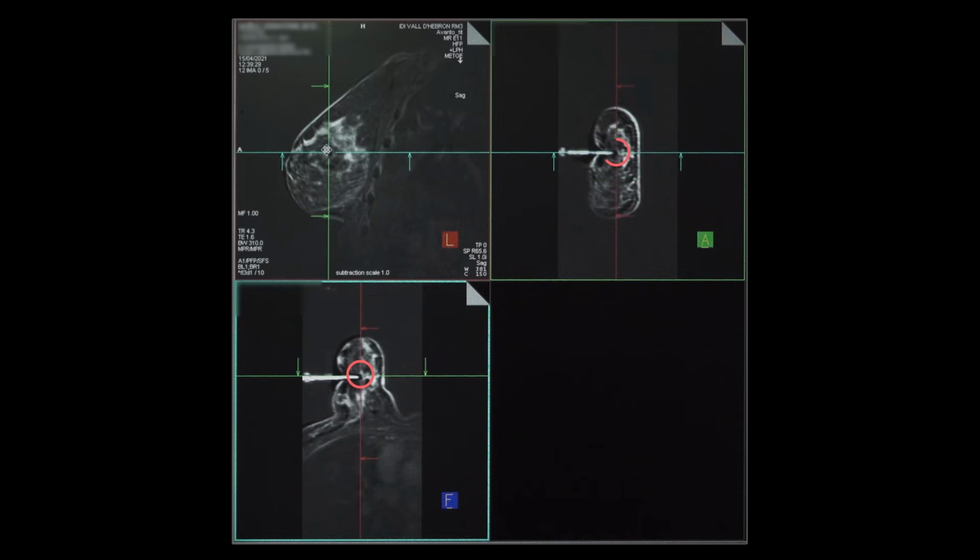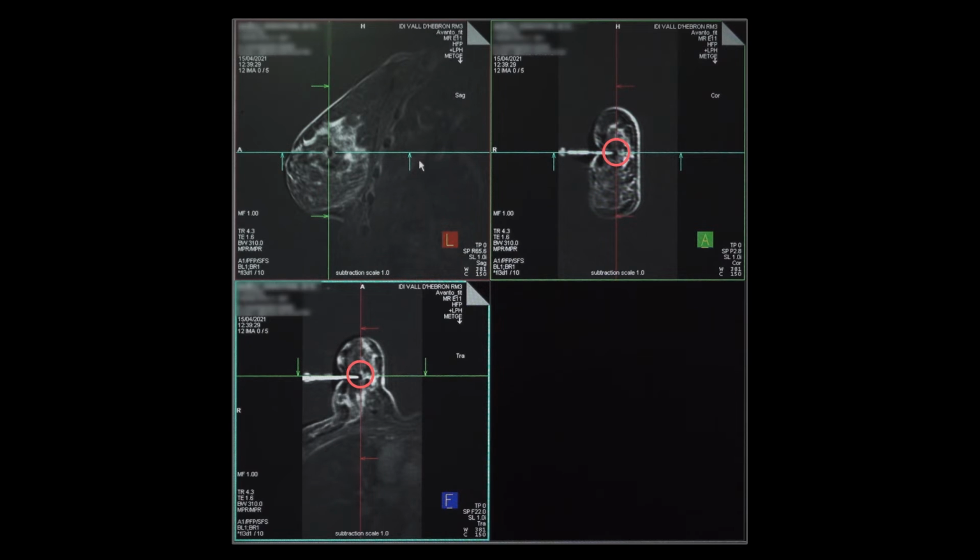The just acquired MRI images are reviewed. The end of the obturator and the lesion are displayed. Compare their coordinates. In this case, the VisiLock obturator is in the lesion, so we can proceed with probe insertion and sampling.